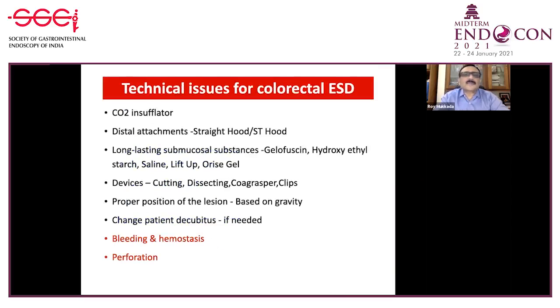So technical aspects: you need a CO2 insufflator when you do an ESD. Distal attachments, as I've already shown, then long-lasting submucosal injection substances like Gelofusine or lift-up or whatever is available. Then devices like dissecting knives, and then coag graspers, clips, etc.